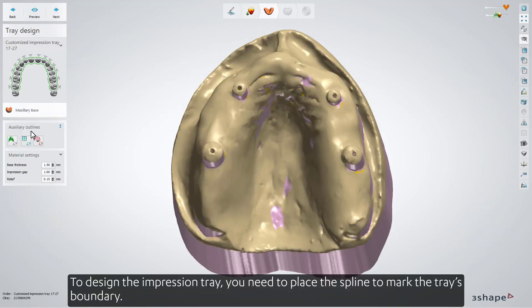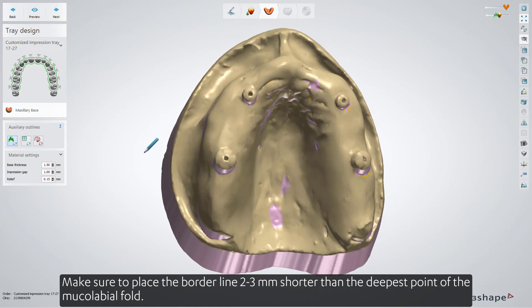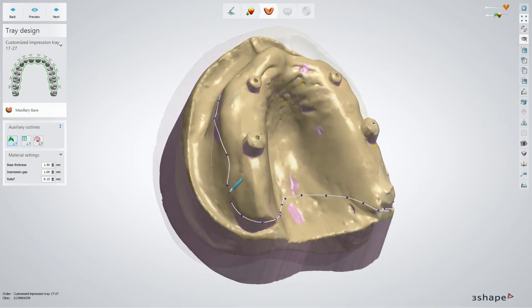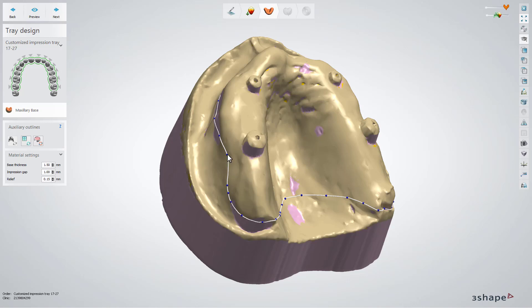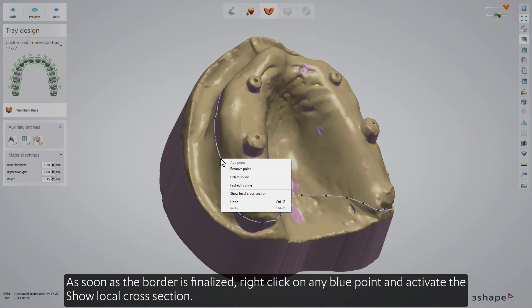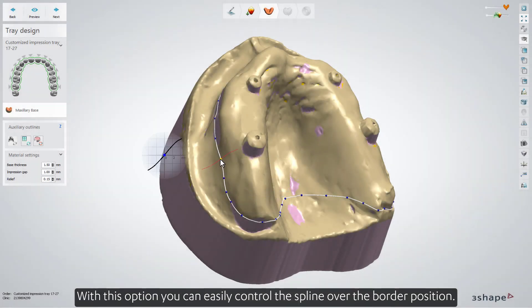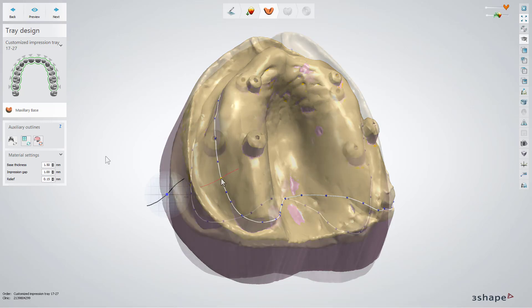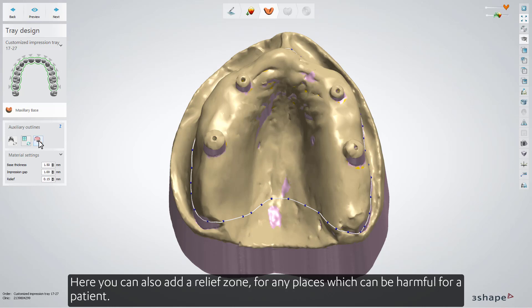To design the impression tray, you need to place the spline to mark the tray's boundary. Make sure to place the borderline 2-3mm shorter than the deepest point of the mucolabial fold. As soon as the border is finalized, right-click on any blue point and activate the Show Local Cross Section. With this option, you can easily control the spline over the border position. Here you can also add a relief zone for any places which can be harmful for a patient.